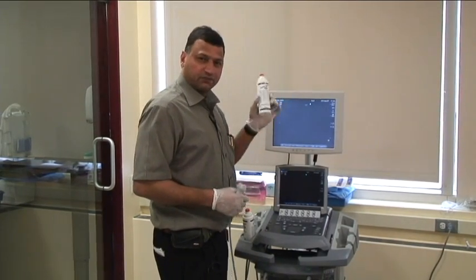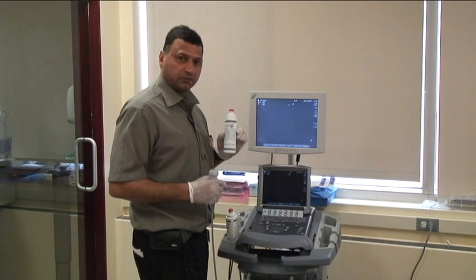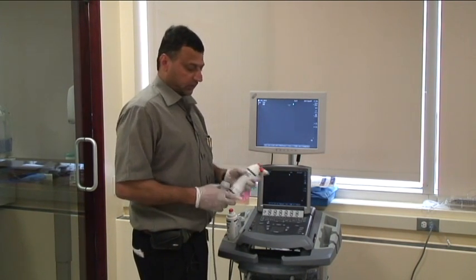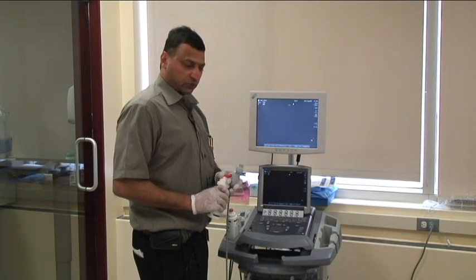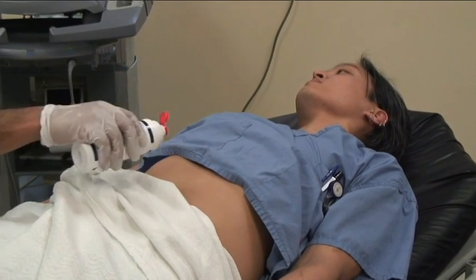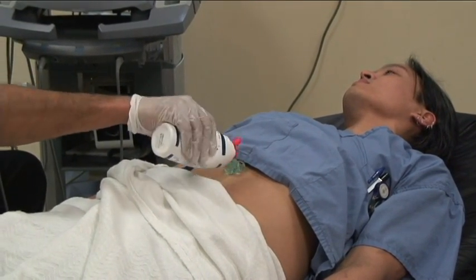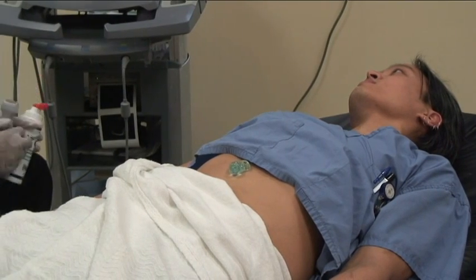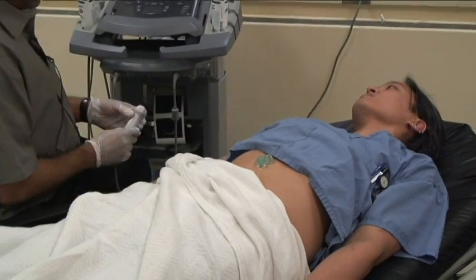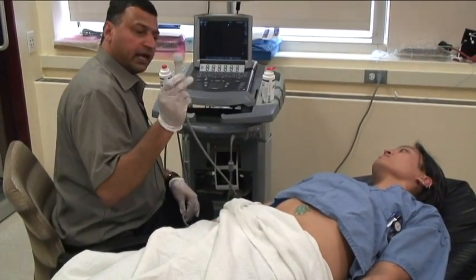Make sure, just like the battery, just like the charging thing, it's very frustrating in the middle of the procedure. You run out of gel, which you need to make sure that you get good windows. All right, so we have our gel here, and James is lying supine. Sort of relaxes the abdomen a little bit. That's important, and sometimes you might even want to ask them to flex their legs a little bit. But let's see how we go. Now, you have the probe in your hand.